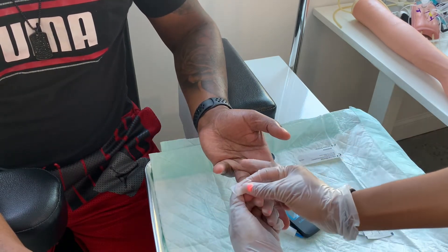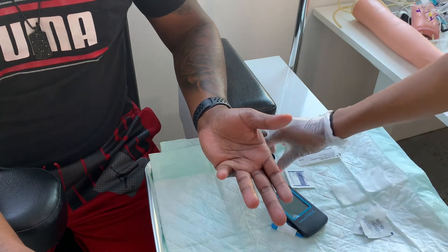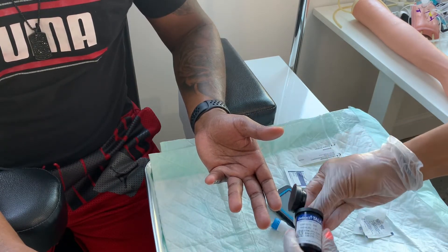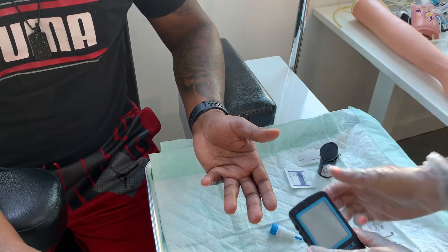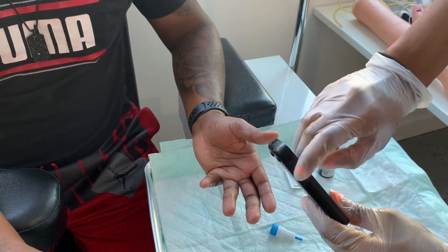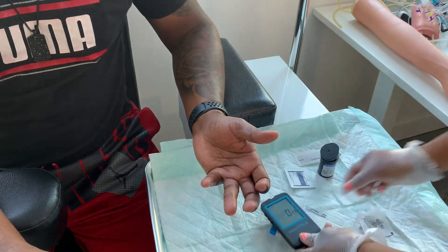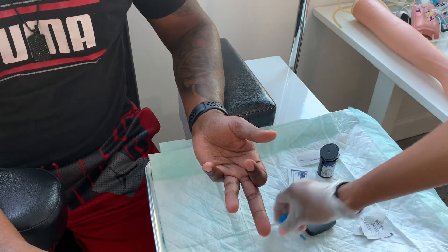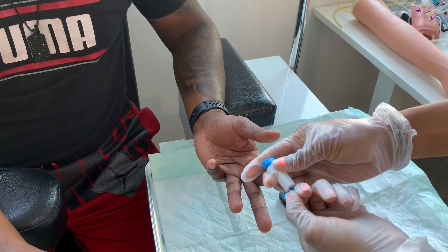You want to make sure you have your alcohol wipe to clean the person's finger, to get all that dirt and oil off. You want to make sure you have your strips — these strips are used to tell the glucometer what levels the patient's glucose levels are at. Make sure your glucometer is on. This machine is called the glucometer, also known as a POC, point of care testing, which means you get the results once you actually complete the test.